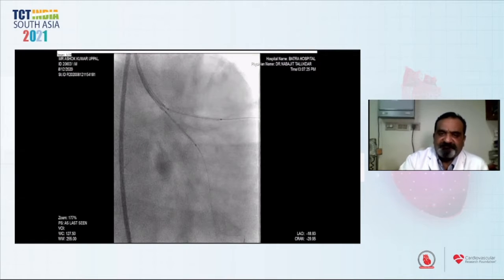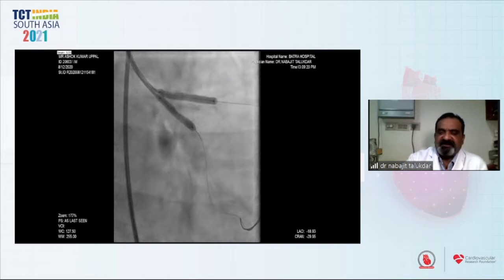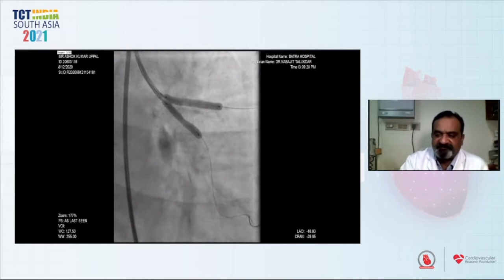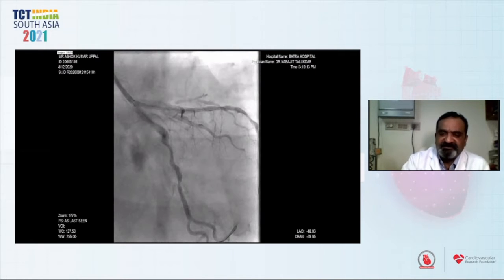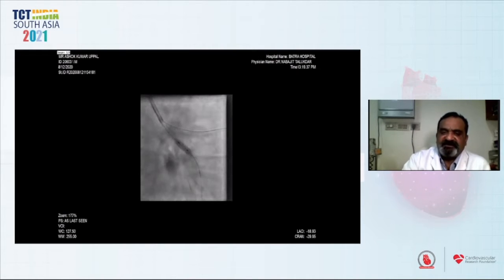Once we put the stents, we deployed them simultaneously at nominal atmosphere pressure, going 2 mm high — that is, for the Yukon stent it was 11 and we went to 13 and 14 atmosphere pressure. Subsequently, there was a distal circumflex lesion which we decided not to address.